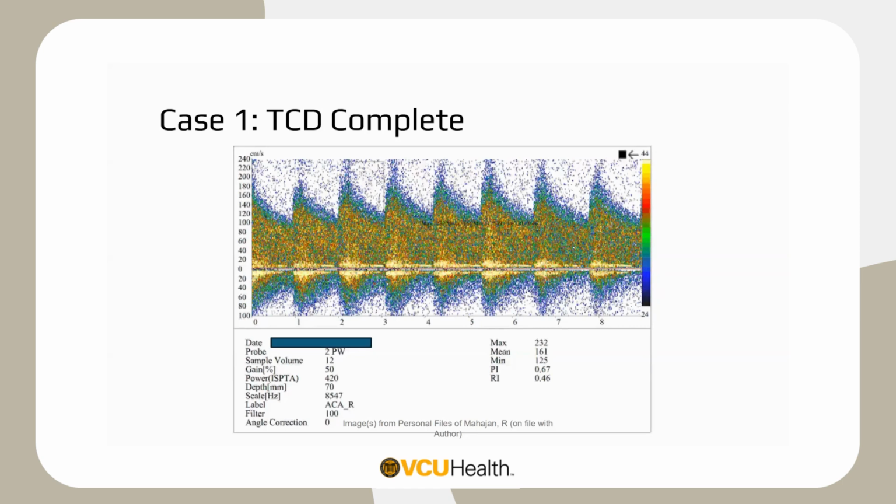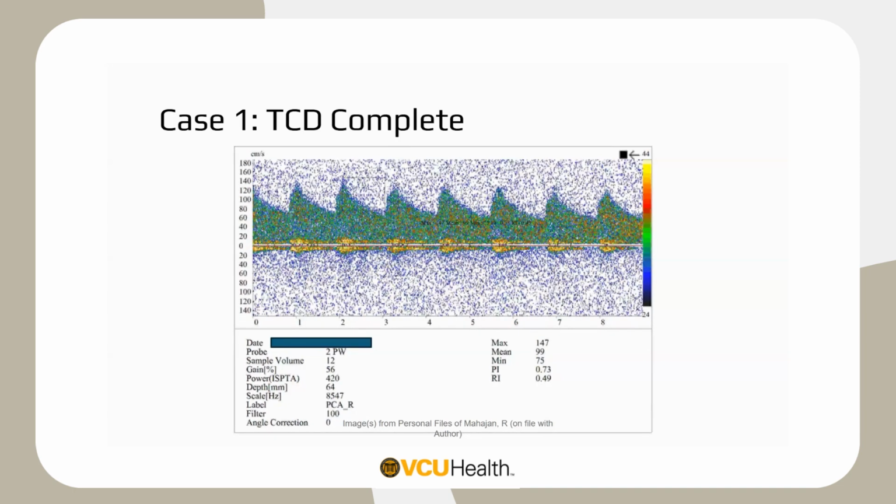And then if we recall, we also had a high velocity in the contralateral ACA. So a pattern that adds up to a flow across the ACOM, having cross-filling from left to right collateral flow. And then the right PCA, we see elevated velocity, more so than we saw in the left PCA. The left PCA was in the 70s. The right PCA is up 99, close to 100. So very high velocity for a PCA. And otherwise, low resistance waveform in a normal direction in normal PI.